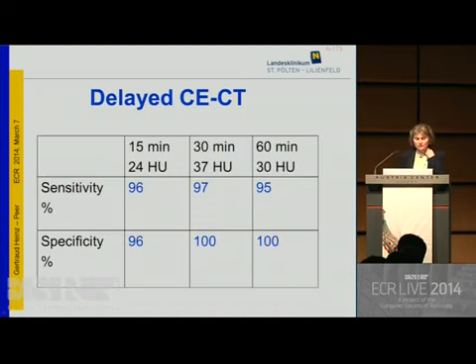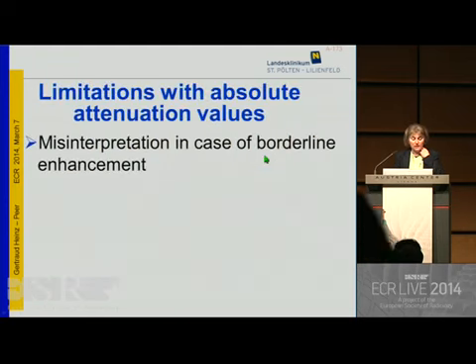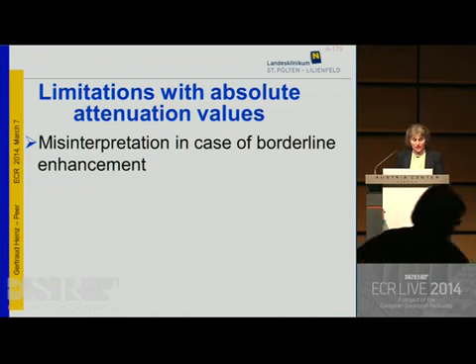And there is a lot of literature. However, there is no unique threshold value. Different authors used different threshold values and also different time windows. And unfortunately, again, with the use of absolute values, there's always the problem with misinterpretation in case of borderline enhancement.